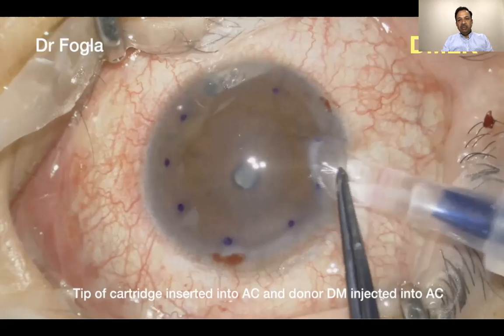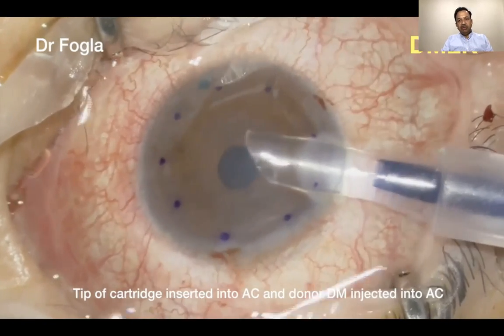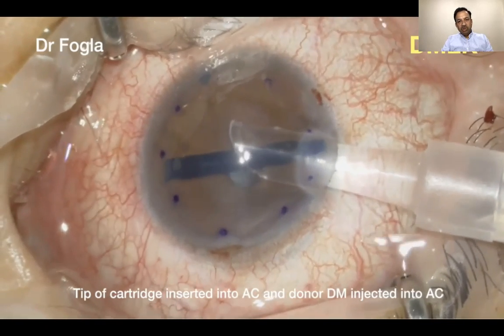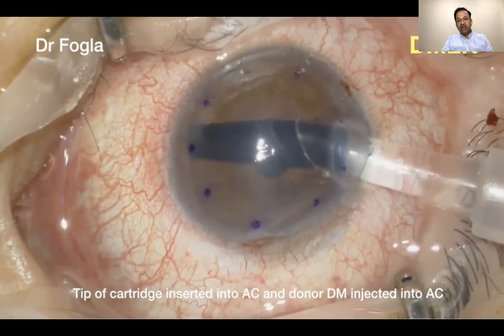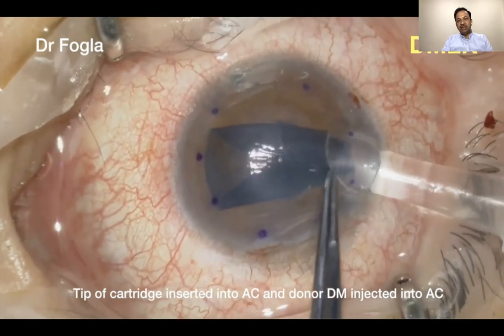In comparison, for DMEK, the donor DM, to improve its visibility, is stained with trypan blue. And the stromal side is also marked in a similar manner to help identify the orientation. The tissue can be flushed into the eye, or it can also be pulled into the eye, pretty much like a DSEK surgery, but the more popular technique is flushing the donor into the eye using a glass or a plastic cartridge.